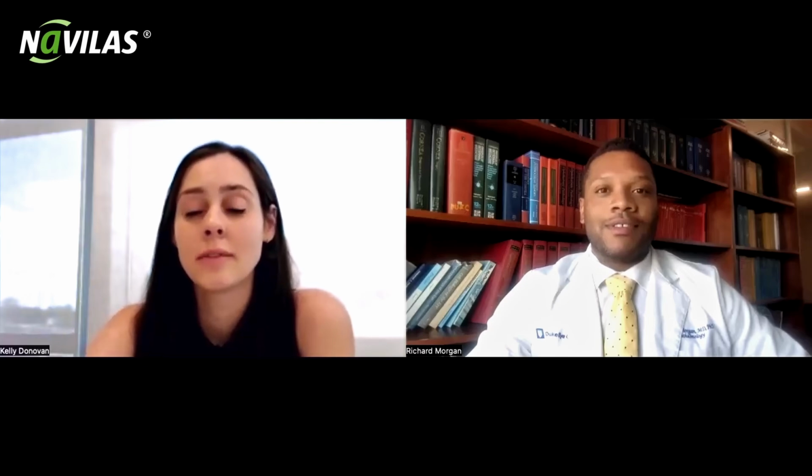In our training program, in addition to indirect and direct laser, we also have the Navilas laser, which we found to be a valuable educational tool. But Navilas may be new or completely unknown to some of the trainees out there. So Richard, could you tell us what the Navilas laser system is?